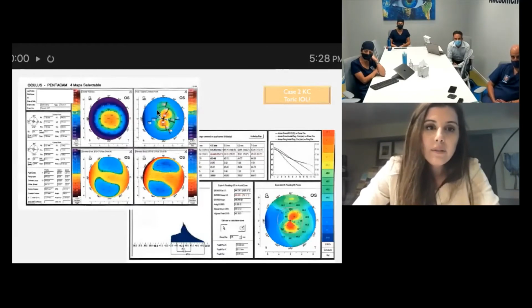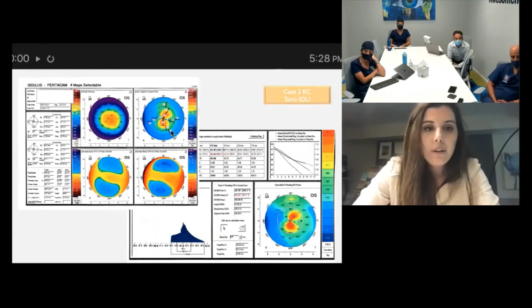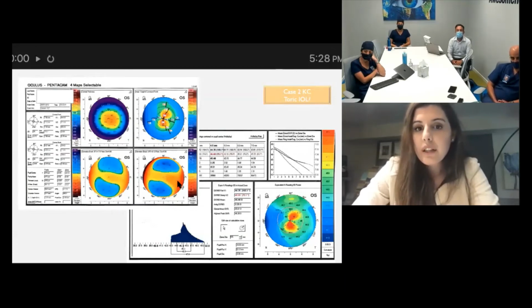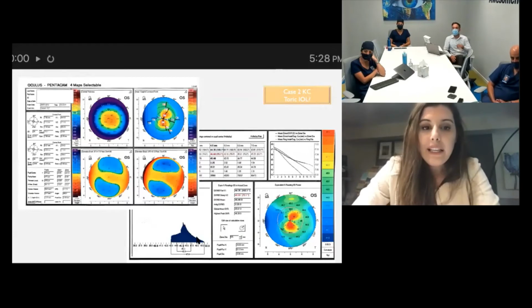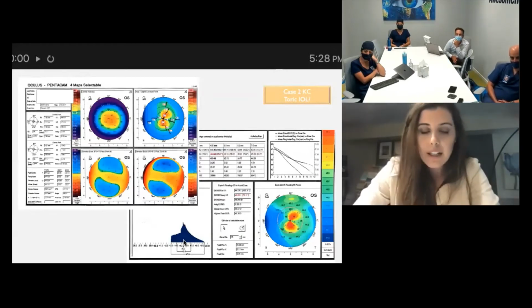It is slightly more stable in the 4.5 millimeter. You can see semi-meridians that are a bit more regular, but you do see a frank posterior elevation. When you look at the EKR, there is definitely a wide range. This is still a keratoconus patient, but there is only one peak through which the patient is seeing, which is the main axis through which he is seeing over here.